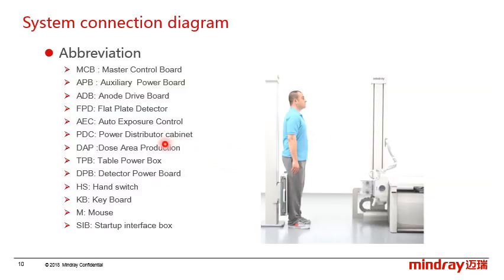Here is the abbreviation of the components, and we will use the abbreviation in the course. Like the MCB, it means the master control board.